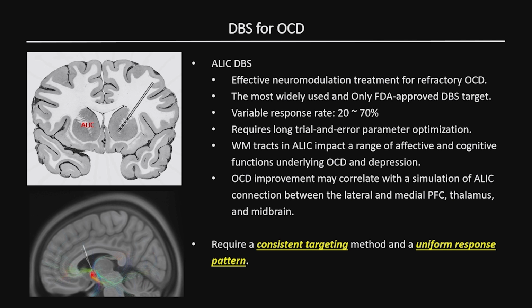Recent literature suggests that white matter tracts in the ALIC impact the affective and cognitive functions underlying OCD and depression symptoms. Probably this OCD improvement may correlate with stimulation of the ALIC connection between the lateral and medial prefrontal cortex, the thalamus, or some of the midbrain structures. So it requires a consistent targeting method and a uniform response pattern.